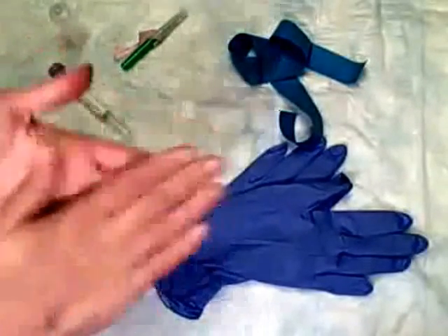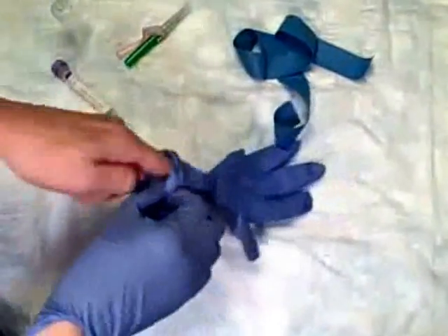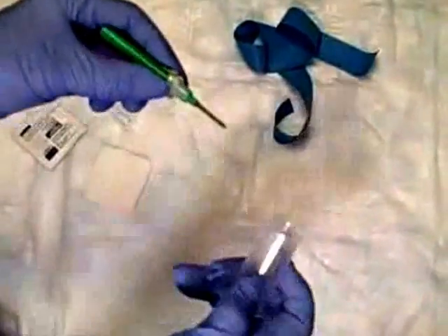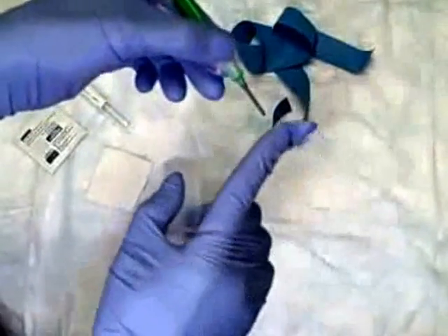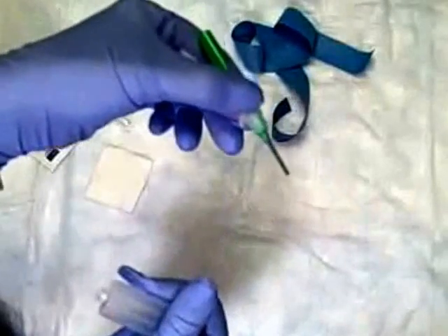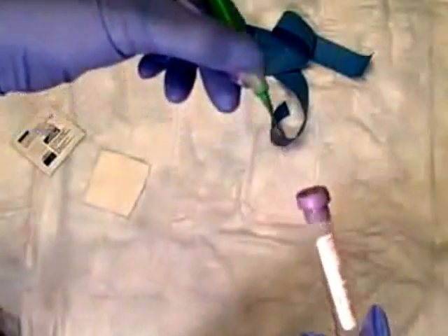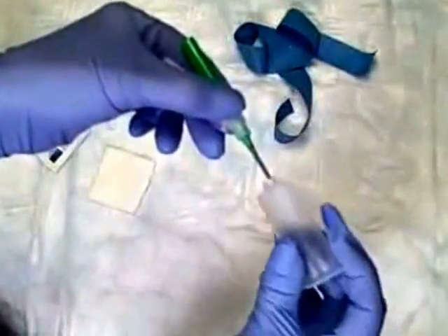I'm going to wash my hands as I would before any procedure, then don my gloves. I'm going to connect the needle to the hub before we begin — it screws in. Be careful, because this is rubber on the outside, but underneath is a sharp needle that pokes into the vacutainer and breaks the seal. If you push hard enough on this, you can stick yourself.